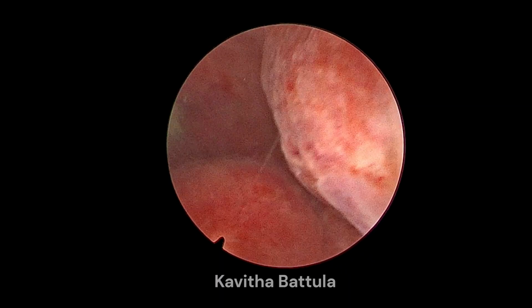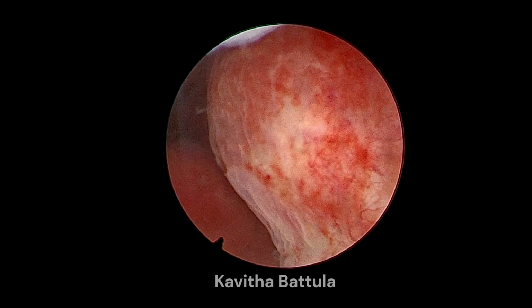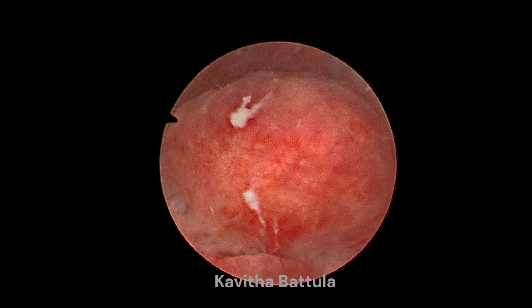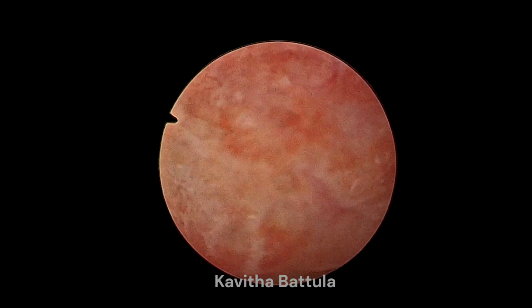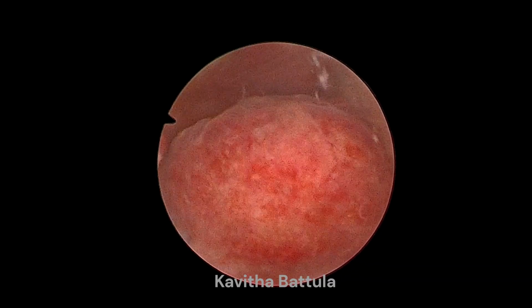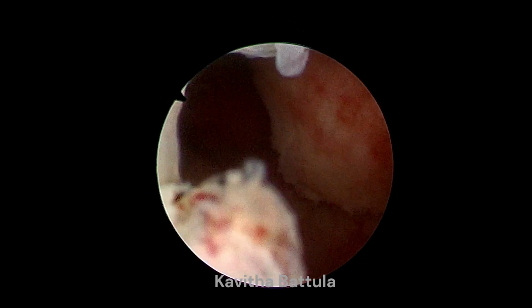Another one is towards the lower portion of the uterus, around 1 to 2 centimeters, and there is another degenerated fibroid of around 4 centimeters, a degenerated area where the endometrium was absent. This is a type 2 to 5 intramural fibroid.